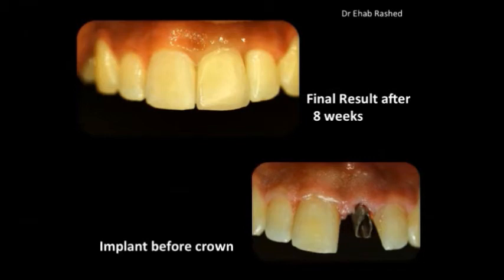As we can see here, we followed the same parameters that we discussed before. The buccal bone was thickened, the soft tissue was measured and it was thin, and it was also thickened, and the implant was placed in the correct position. And after healing, this is what we get in the picture on the top. You see a nice healing of the gum.